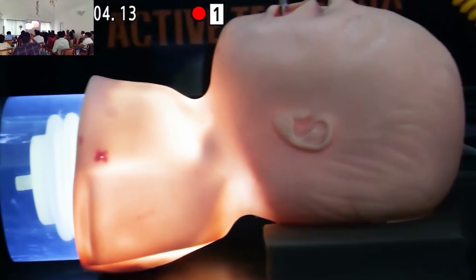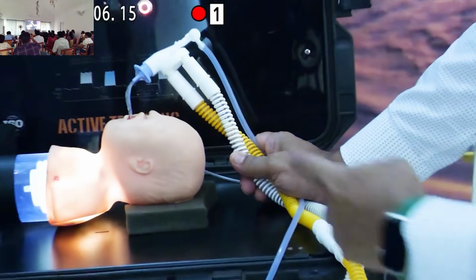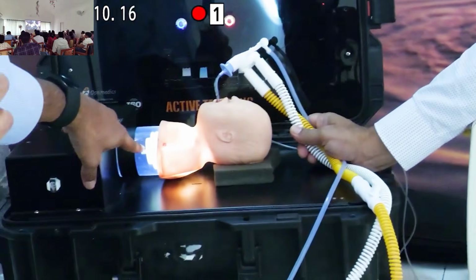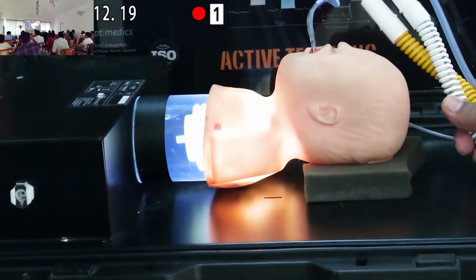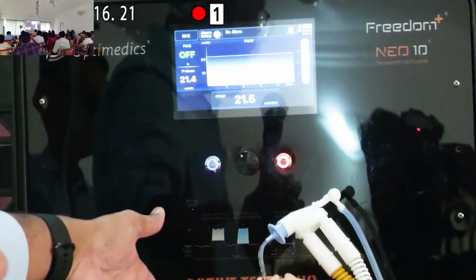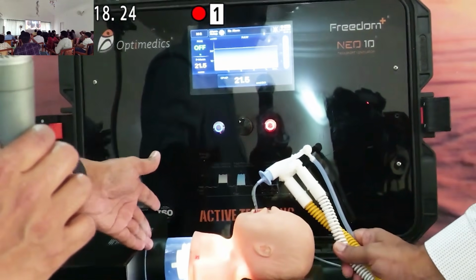And you can see it's a monitor, we can leave it. So you can see here that the lung is not expanding. The pressure increase there is only to make it less compliant here in the intrathoracic area. So that's what happens when the pneumothorax is there.